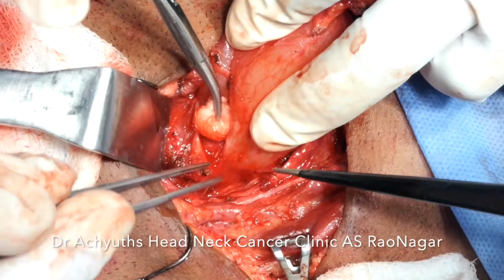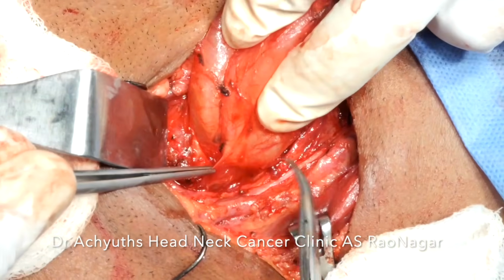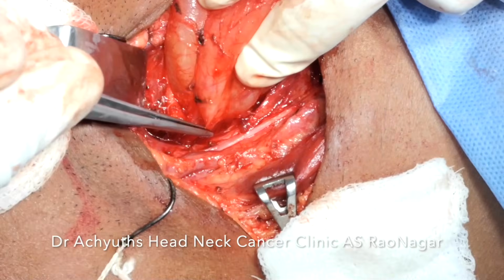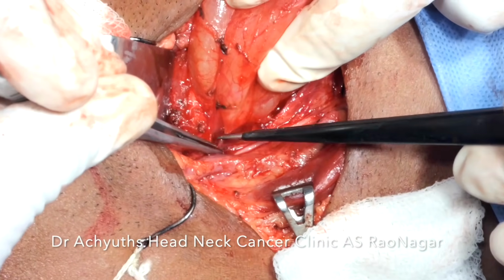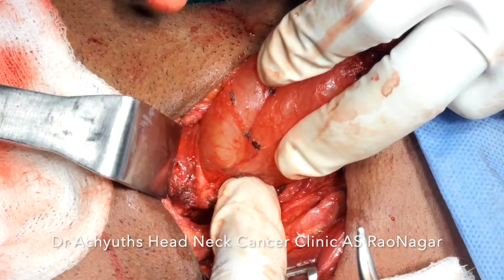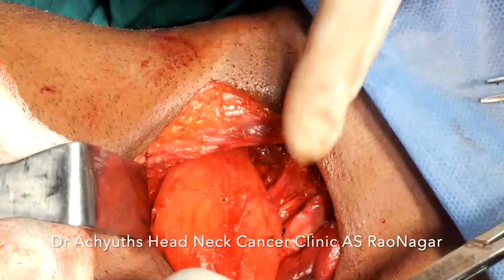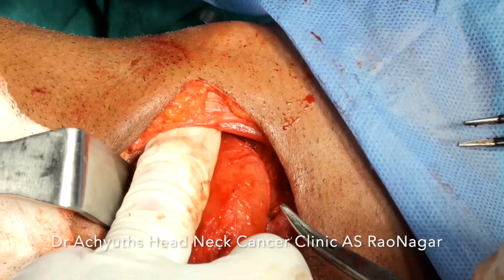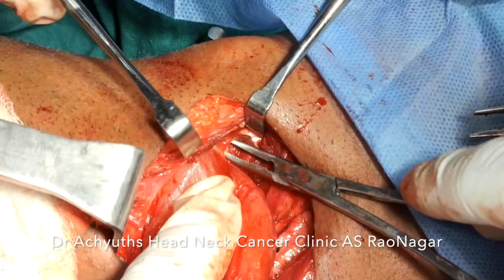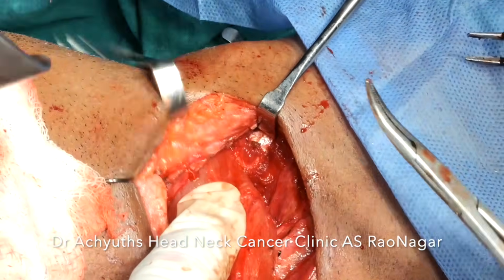And again, it is a relatively boring surgery, but this is all about the surgery, right? So we have to be a little patient. More than the surgeon, the assistants have to be patient. We are just working around the cyst all the time. More or less the attachments on the superior, inferior and lateral parts are done.